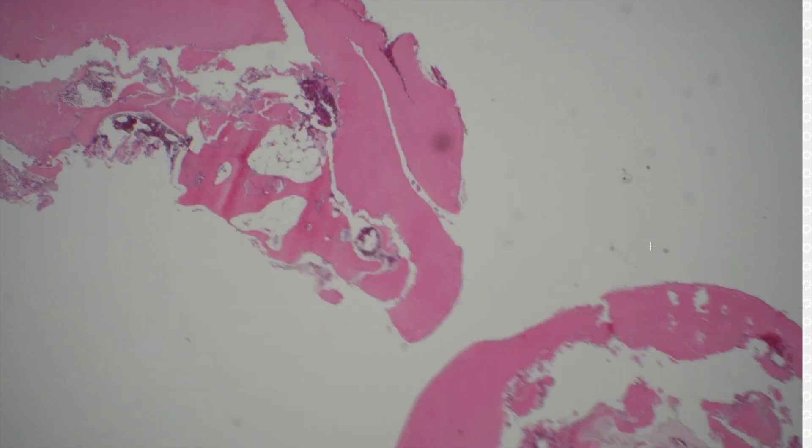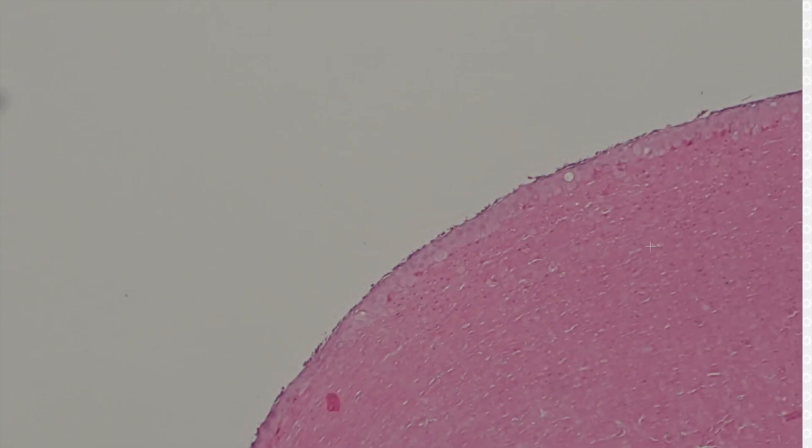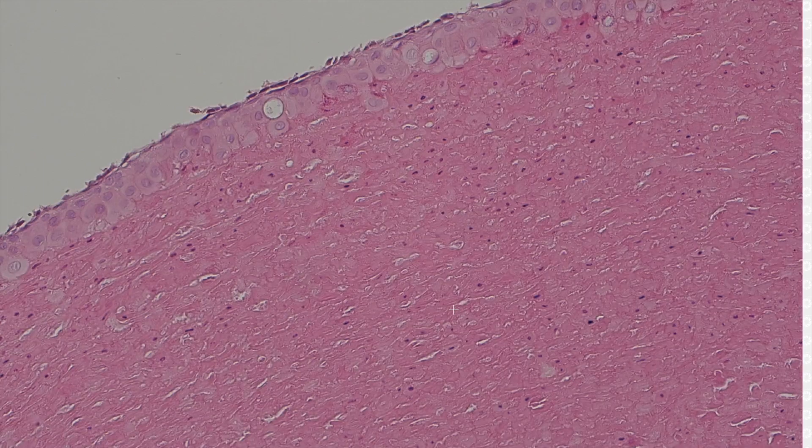Fifteen. Pilar cyst. You've got to go out here at the edge — it's a pale, faded slide — but you can see that lining of glassy keratinocytes that are bland, no or minimal granule layer, and then dense keratin in the middle.